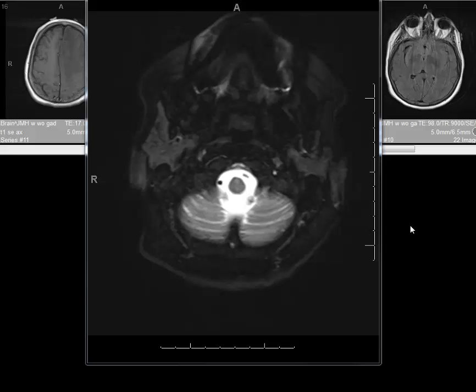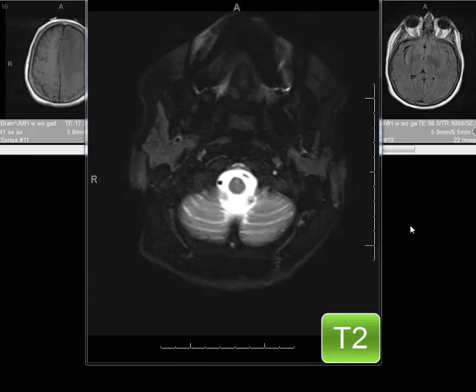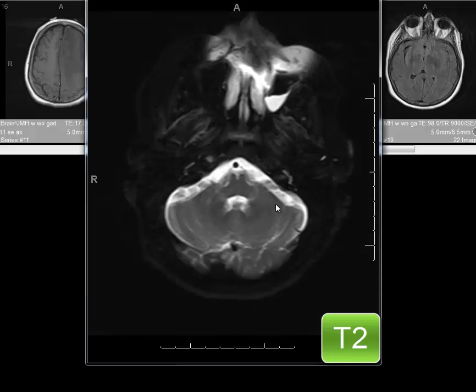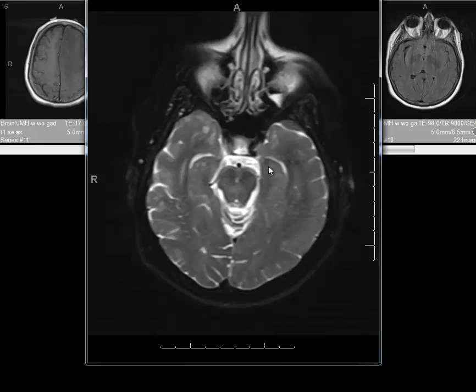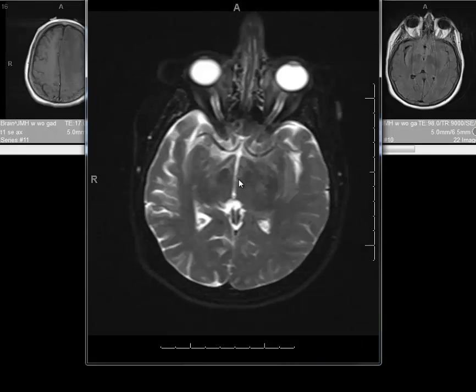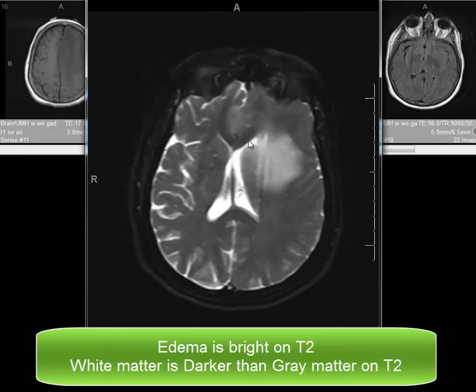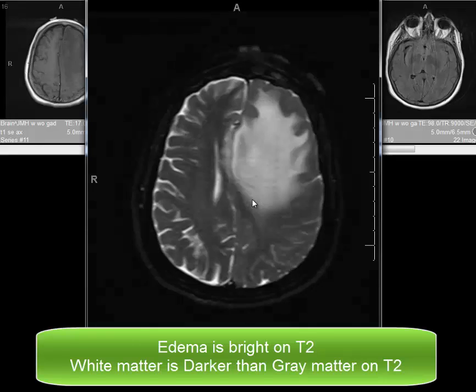Next, we will look at the T2-weighted image. This image is very sensitive to the presence of increased water and can visualize edema to great advantage. The CSF on a T2-weighted image appears bright, so you can see that all of the cisternal spaces and subarachnoid spaces are bright, and the ventricular system is bright.